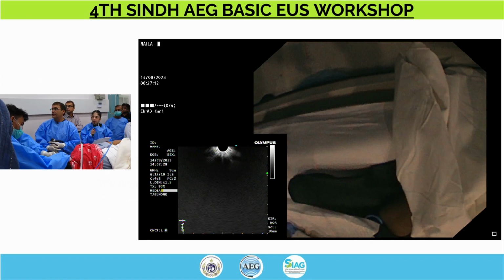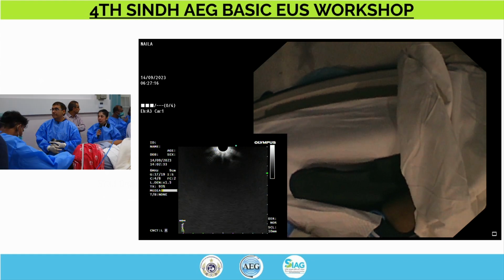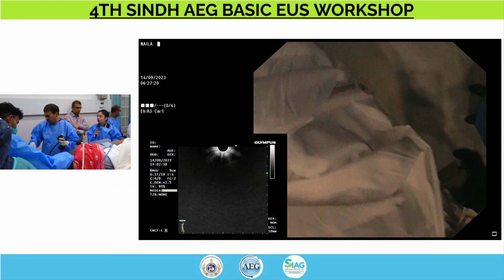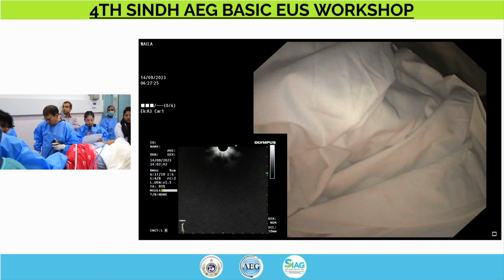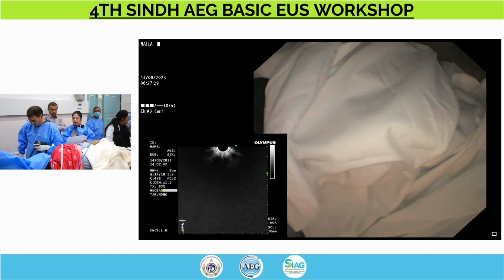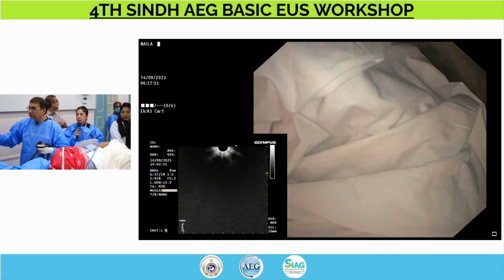The first case that we have is a 35-year-old female patient who had history of epigastric pain. She was evaluated on an outpatient basis and her LFTs were slightly on the elevated side. So she had an MRCP. Data showed evidence of gallstones, dilated intrahepatic ducts, and dilated CBD, which was measuring 1.2 centimeters on the scan, along with CBD stones.